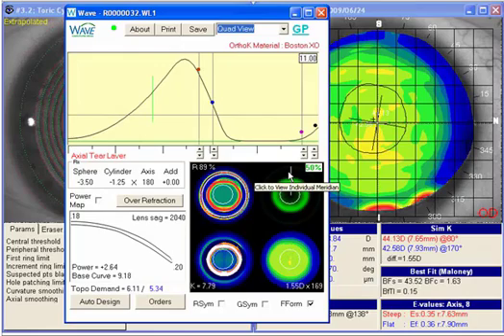That's really all there is to it. It's very simple, very straightforward. After you do a couple, it really starts to make sense. It's not that much more difficult to design the lens than any other wave contact lens. It's really just a matter of knowing when to use it and how to use it.